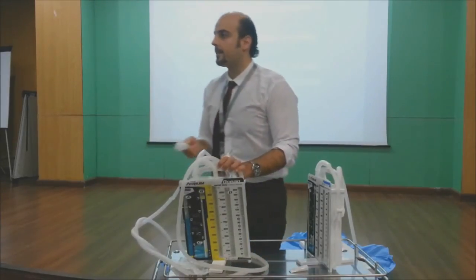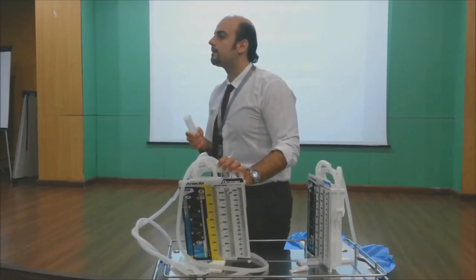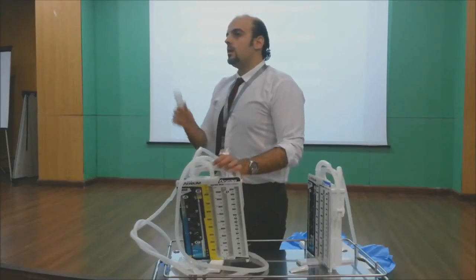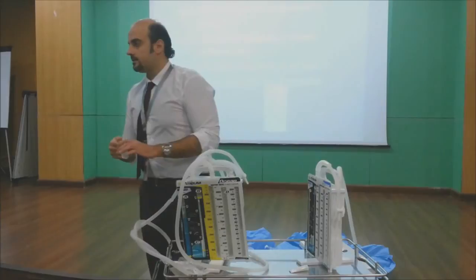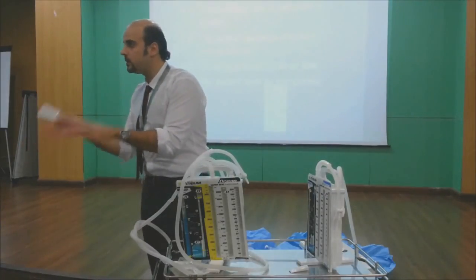What's the actual time to clamp this one? Because sometimes it takes more time initially for the patient, for example, to go up. So it will affect the patient. It depends on the case, as I told you. From now on, you can judge.